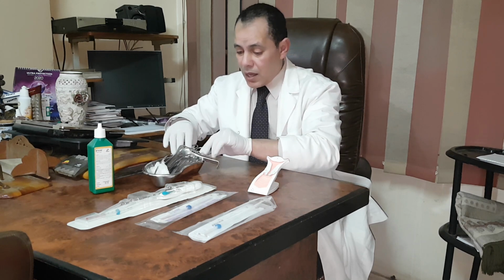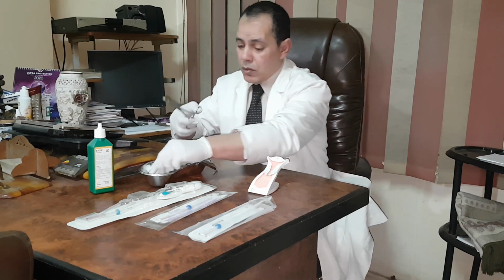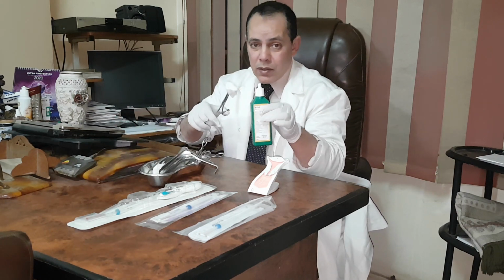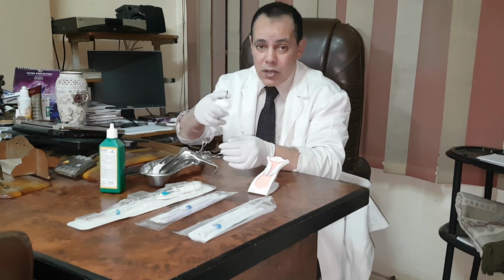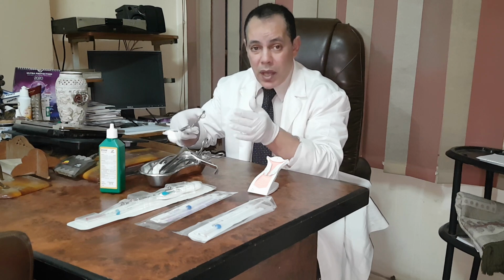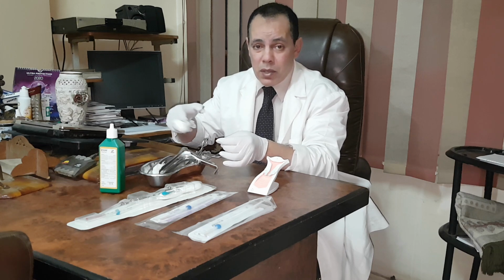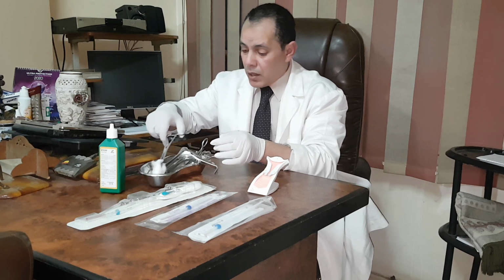What else is needed? I need ring forceps to hold sponge or dressing, sterile, with antiseptic solution to clean the external genitalia, the vagina, and the cervix from any mucus discharge. And of course, if there is any infection, I should treat it first before insertion of the IUD. So don't insert an IUD if there is genital tract infection. You should manage the infection first, then you insert the IUD. But you use antiseptic to clean the cervical mucus first and any vaginal discharge. Okay.